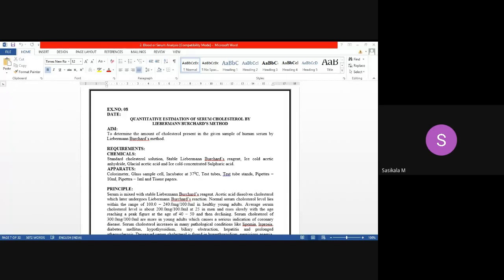Dhanush, once again you can give the explanation on deproteination of blood. When the protein present in the blood is precipitated by tungstic acid, the filtrate is known as protein-free filtrate. This method is based on the precipitation of protein in blood by large ions. On adding the acid, the blood is laked very rapidly and the hemoglobin is changed to acid hematin. No precipitate is obtained until the sodium tungstate is added. The color of the residue is reddish brown and the color of the filtrate is colorless.